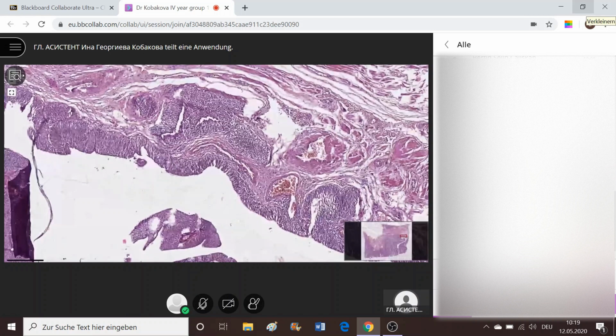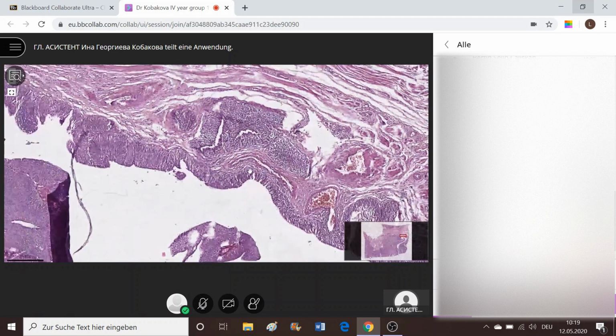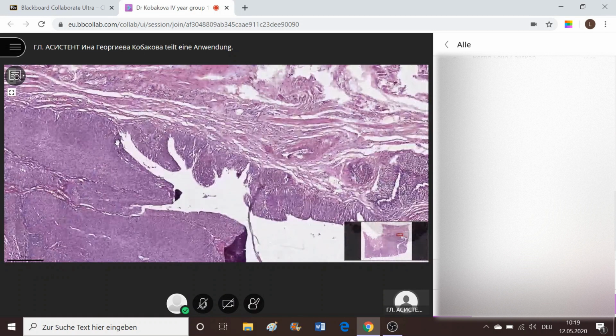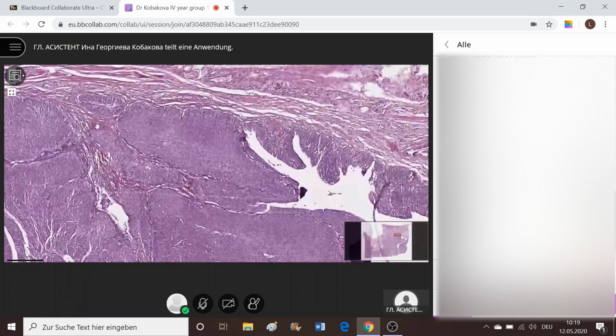And later, we continue to other fields inside the tumor, where the urothelium is on much more than 7 layers of cells, which we usually should expect to see. It's forming papillary structures, small lines of stroma in between the structures, which are actually fibrovascular stroma fields. They are feeding these papillary structures.